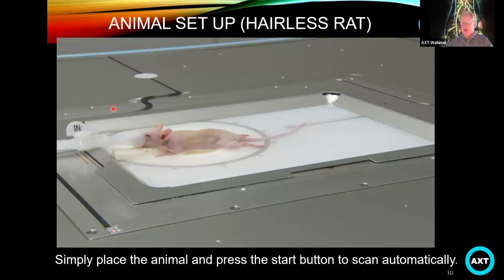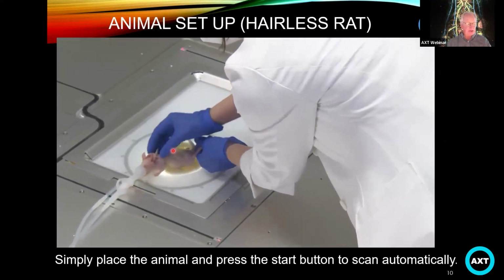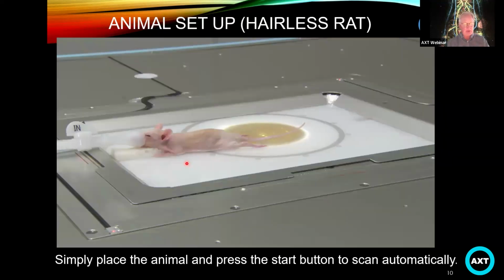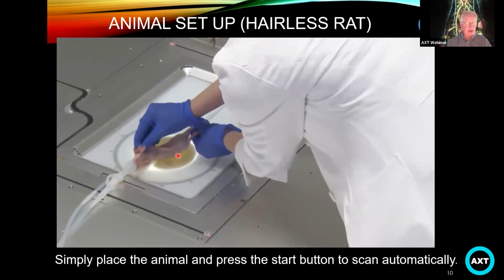even though the nominal field of view of the detector array is 22 by 22 millimeters, the actual largest scan area that we can scan with the system is 290 millimeters by 180 millimeters. A scan of that size would take approximately 4.5 minutes.